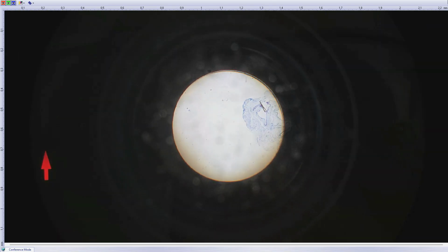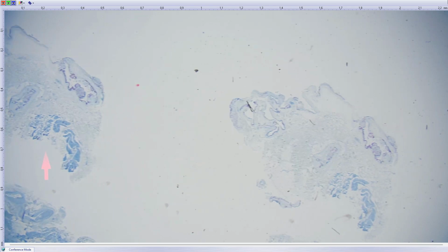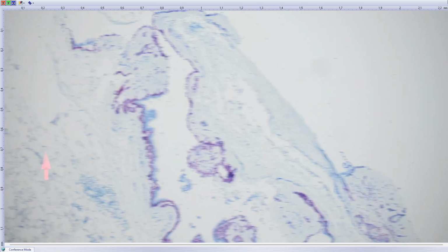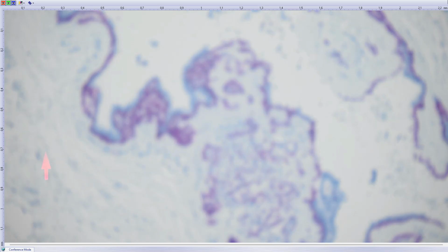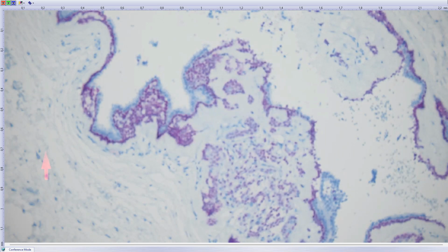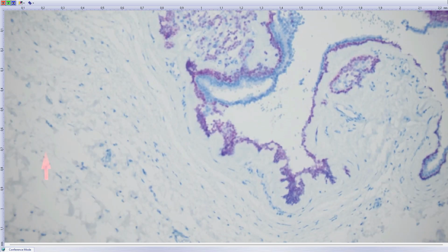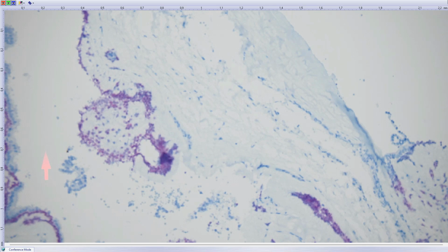And again, when you make PLAG1 staining, you see nice positivity. That means it's a pleomorphic tumor of the skin or mixed tumor of the skin. And there will be some PLAG1 fusion behind it, yeah. So it's not just cystadenoma, it's a cystic lesion in which this tumor starts.